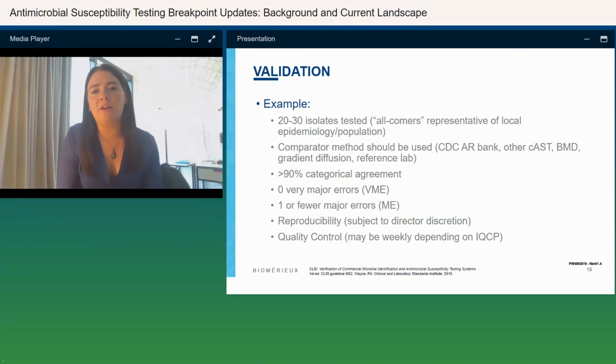The example here is pulled together from the CLSI M52 document, as well as some webinars that have been provided by CLSI, which have been really, really wonderful. I highly recommend, if you're working on developing a validation protocol, that you access the resources CLSI has available. They've offered lots of great examples of how one might think through development of one of these protocols.